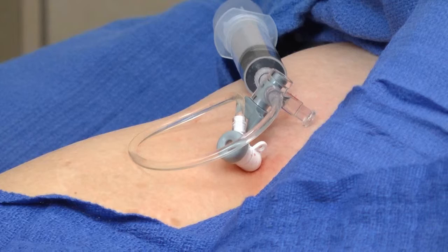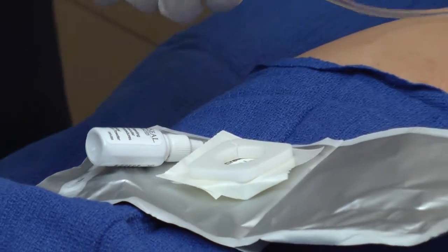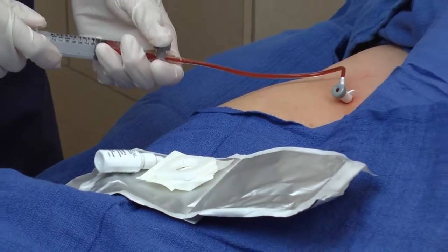While appropriate for the control of any external bleeding or oozing, an arterial sheath removal was used for demonstration purposes in this video.